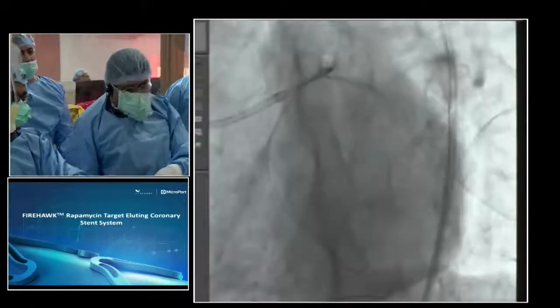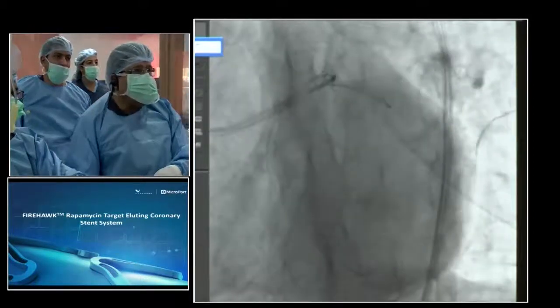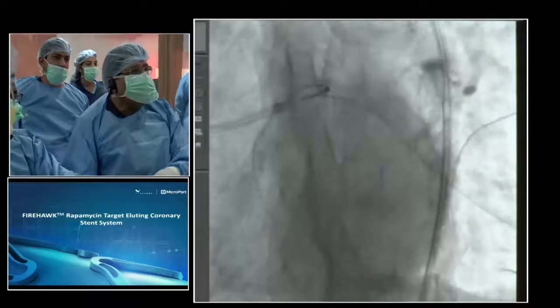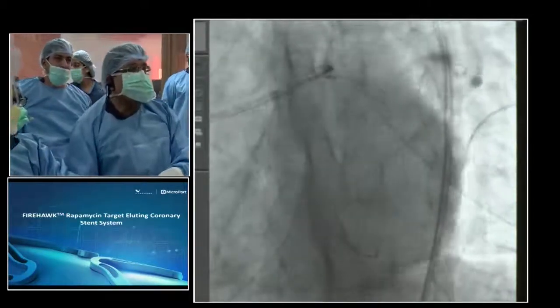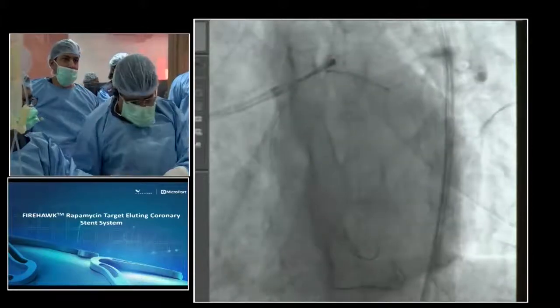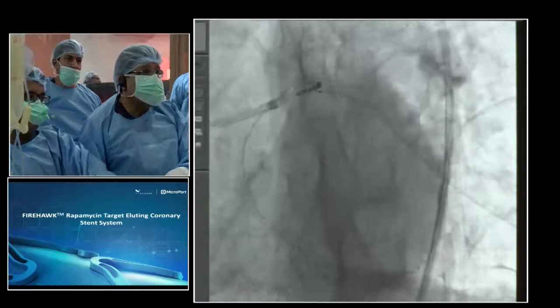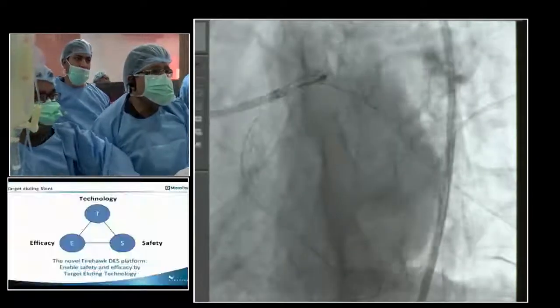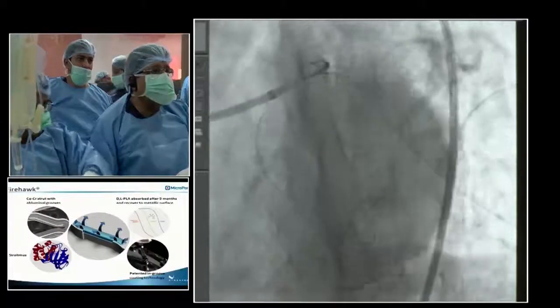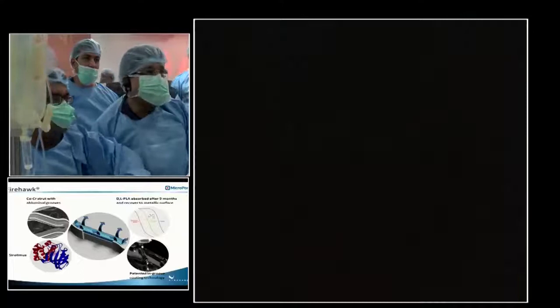And also have this stent a little distal, because it may still be possible to pull the stent, but sometimes it may not be easy, or even impossible, to push the stent in case your stent is more into the left main. May I have a test, please? Some good testing. Pull the LAD stent more. Test, please.